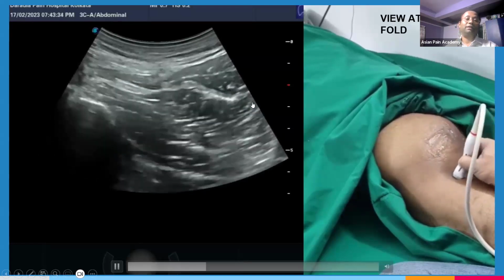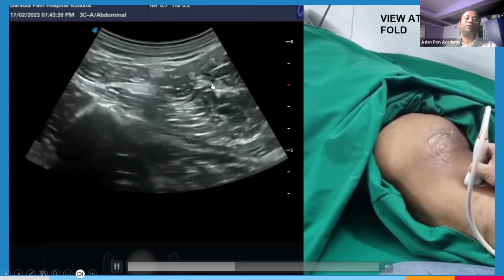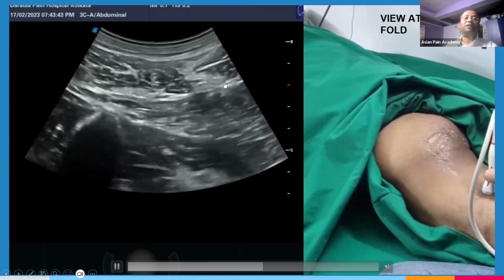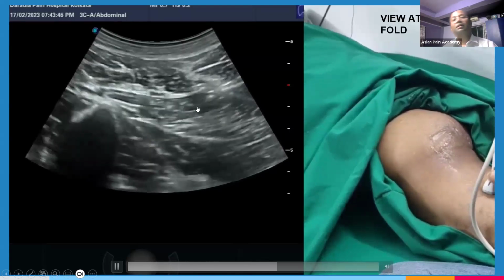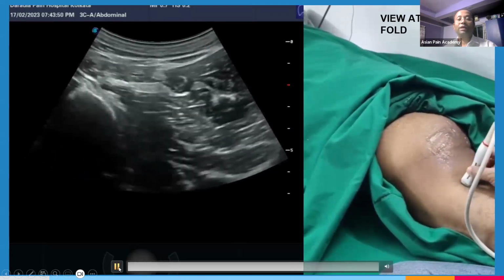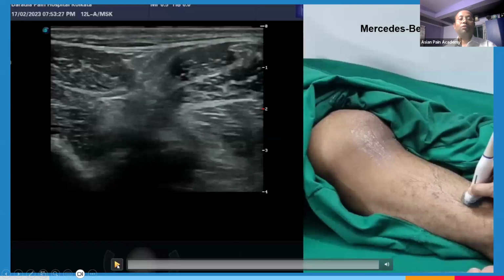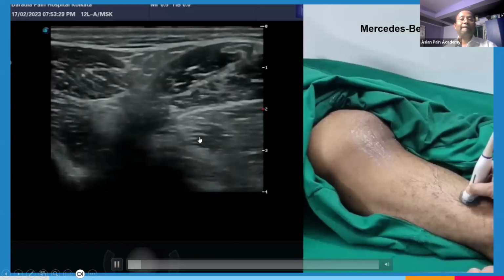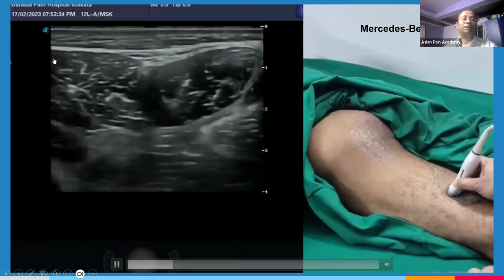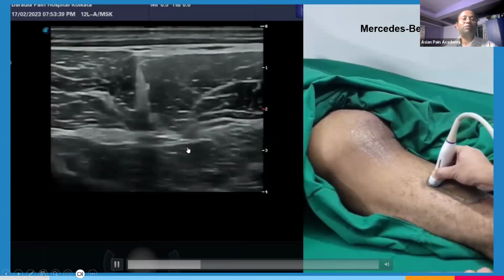And so here is a spermatozoa-like structure, a spermatozoa-shaped structure. This structure is nothing but the semimembranosus tendon. Okay, so we will start from below actually. So from here. So now we are starting from below. See, semitendinosus, semimembranosus. This is the biceps femoris, lateral side. Biceps femoris, semitendinosus, and the semimembranosus becomes small.